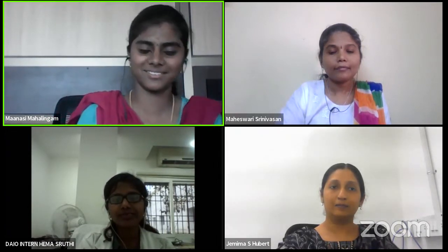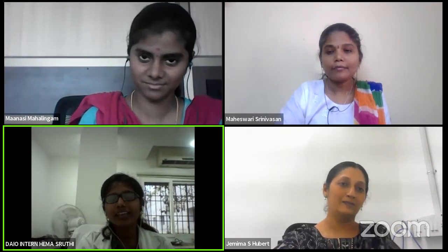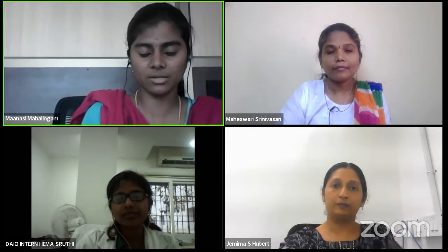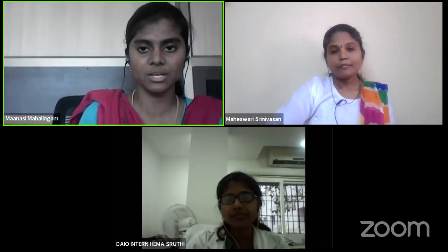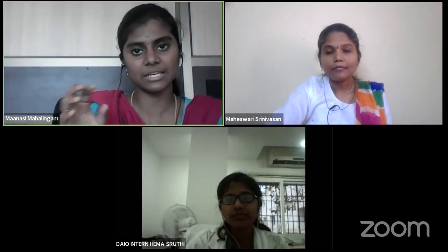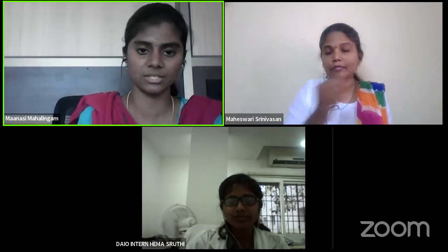Hema, can you give a try? When will the fovea be thinned? In some detachment, like in loss of tissues, ma'am. Like telangiectasia. Yeah, perfect. So in telangiectasia, the fovea will be thin. Okay. And then one more factor is the subfoveal choroidal thickness, which also has to be looked at in the OCT report. Not everyone will mark and send the report to all the patients, but clinically, we should write about the foveal thickness and subfoveal choroidal thickness.